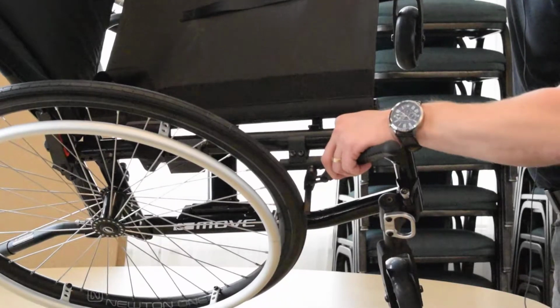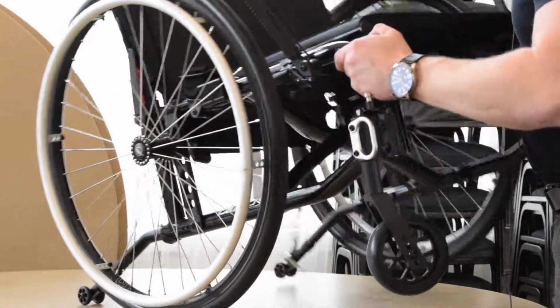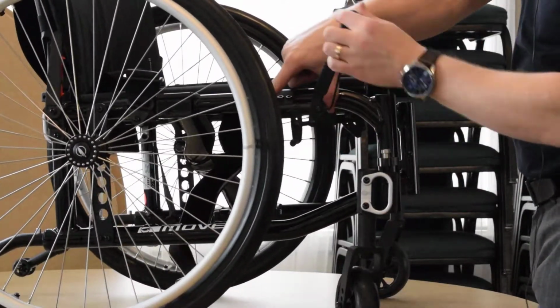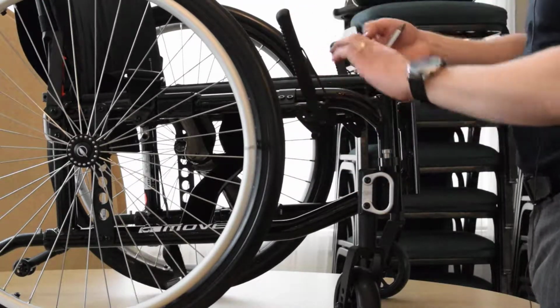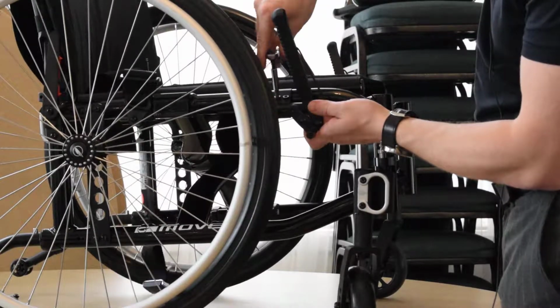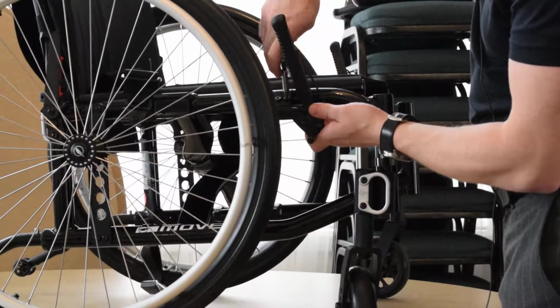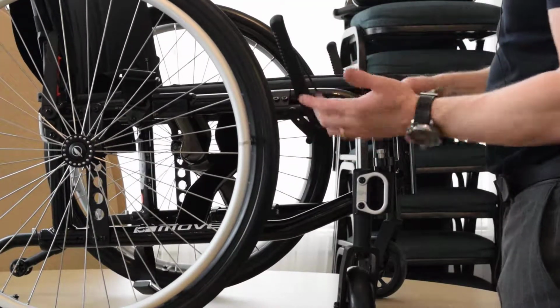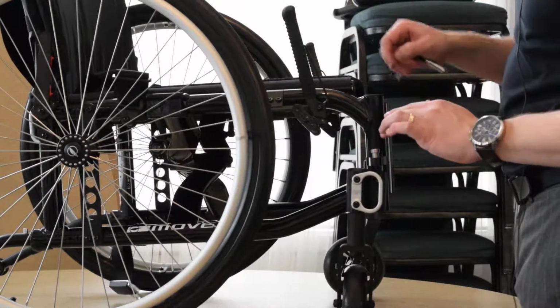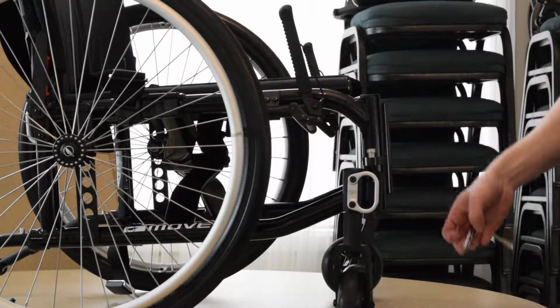So I'm going to loosen those 2 bolts off, but I'm not going to loosen them off too much. I would just want to loosen them off enough so that I can maneuver the pole here and play around with the brake, but not too much where everything just starts falling off of the frame. So counterclockwise, I'm going to spin that bolt there, and you're noticing that I'm not loosening it off too much. It's still staying intact, but I can actually manipulate it however I want. If you loosen it too much, then you're going to have to hold everything together while you're trying to figure out the right position for it.